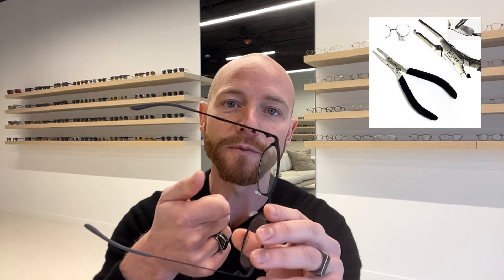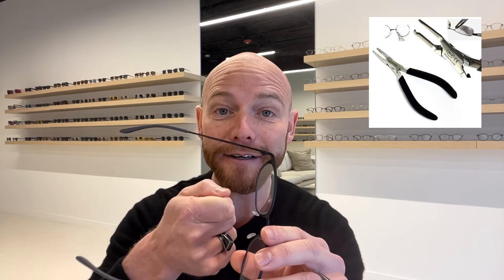There are tools specific to opticians — nose pad pliers — that are specifically tuned for this, but most of you don't have those. You can use needle nose pliers from your toolbox at home, but there's a danger of scratching the lens, and if you're not used to using them, too much torque can actually break those nose pads more easily.